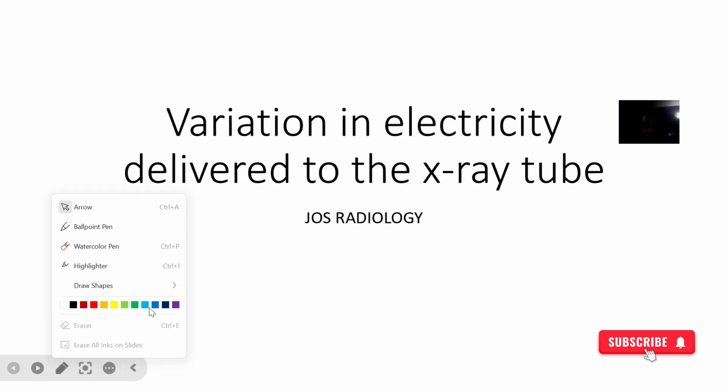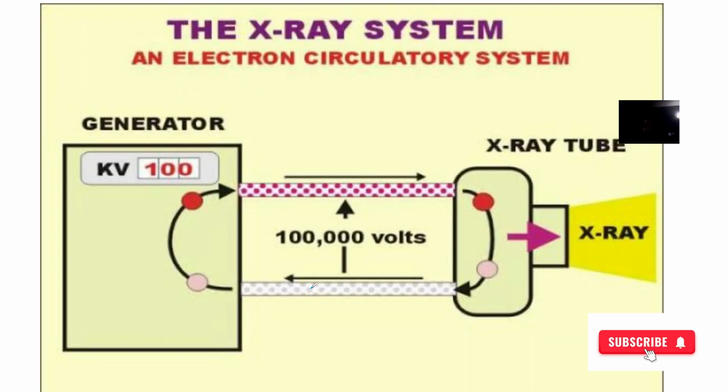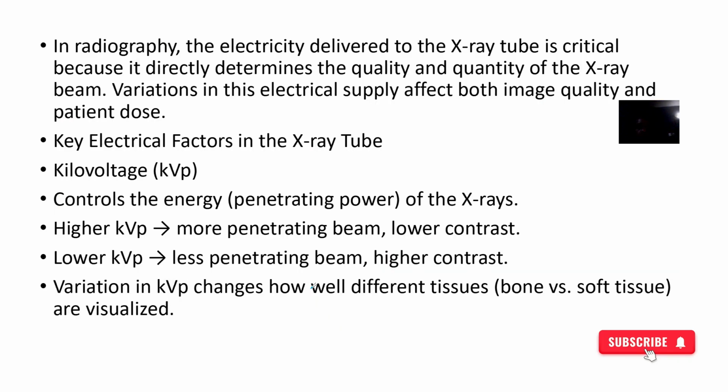We get to look at variation in electricity delivered to the X-ray tube. So what is this aspect, and what do we sort to look at in this talk? So in radiography, the electricity delivered to the X-ray tube is very, very important.